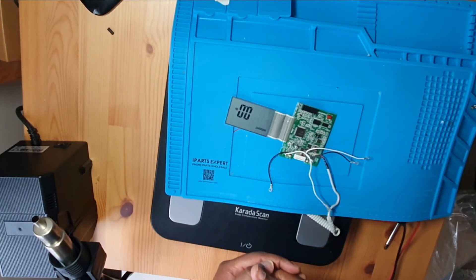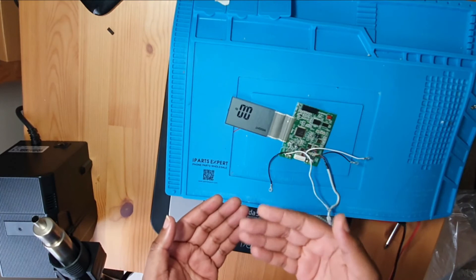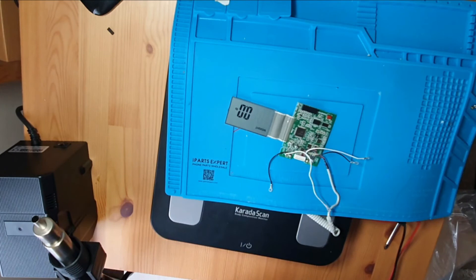So just by heating it up it must have reflowed it — just made it adhere properly again. I'm not sure if this is going to be a long-term fix, but it worked for now. I'll leave it for a period of time and after that we'll test it and make sure everything is working.